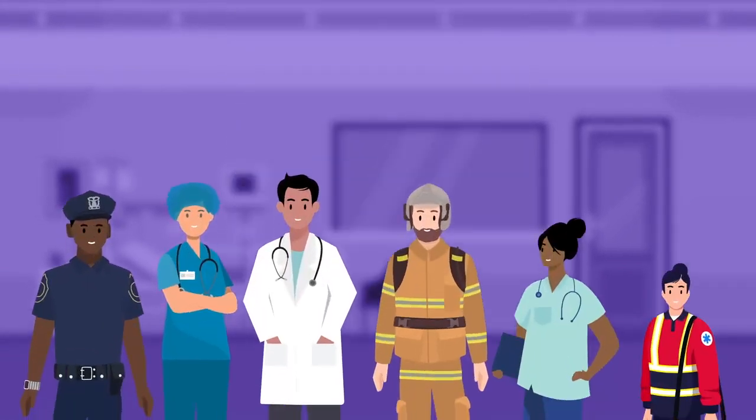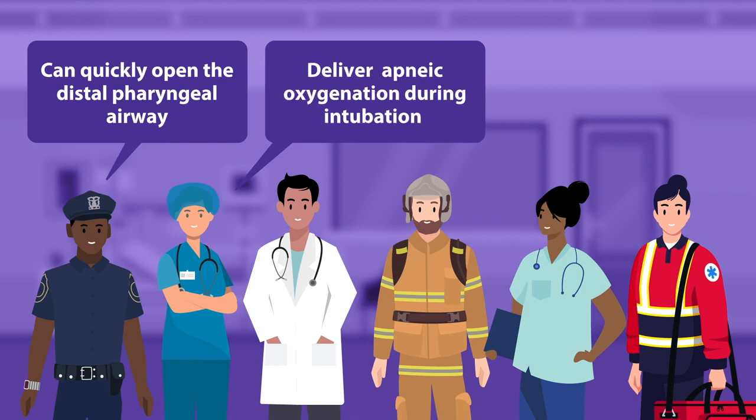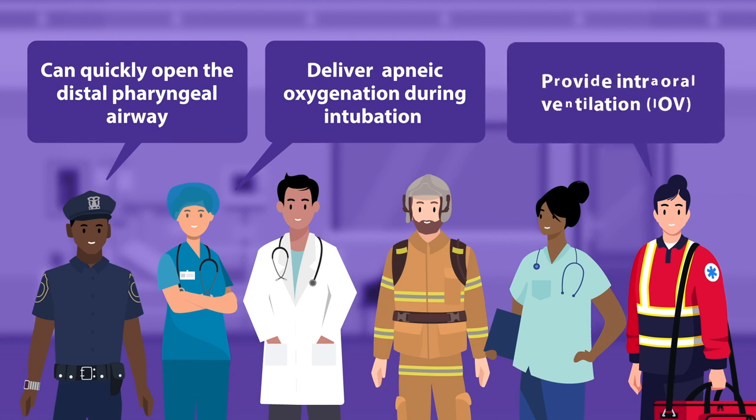In summary, the MEA opens the distal pharyngeal airway to support spontaneous breathing, delivers apneic oxygenation during intubation, decreases the fire risk in sedation cases, and provides intraoral ventilation to ease positive pressure mask ventilation.